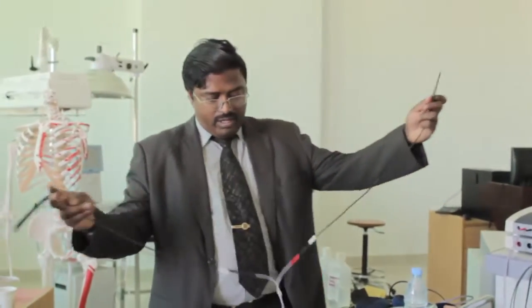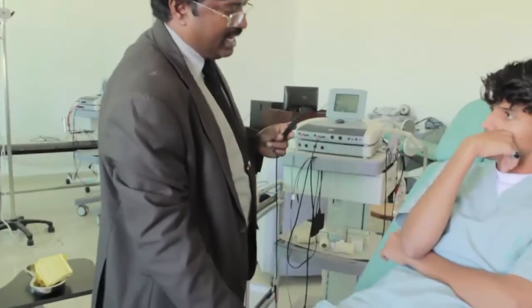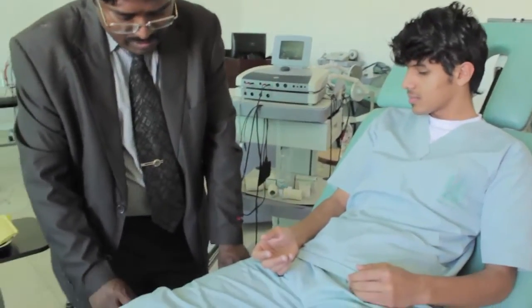So now, before applying, we have to find out what is anode and cathode. We already know the procedure. This black one is cathode, the red one is anode. So if a patient comes to me with bicipital tendinitis, a problem in the biceps tendon, then my anode will be on the biceps tendon, and the cathode will be on the opposite side. I will show you the procedure.